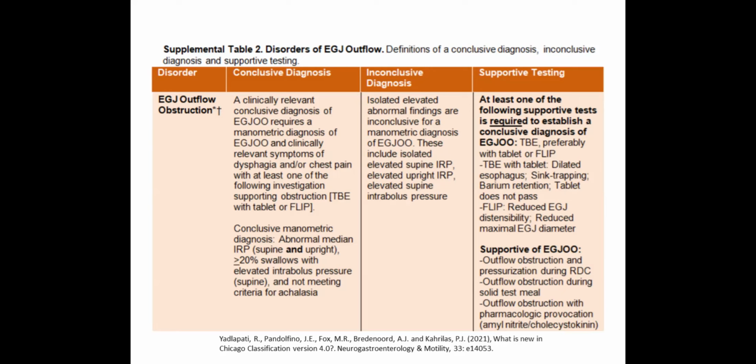It needs to be both raised, according to the upper limit I mentioned earlier. If you're using MMS, it will be above 15 in supine and above 12 upright. For Sandhill, it will be above 20 supine and 15 upright.